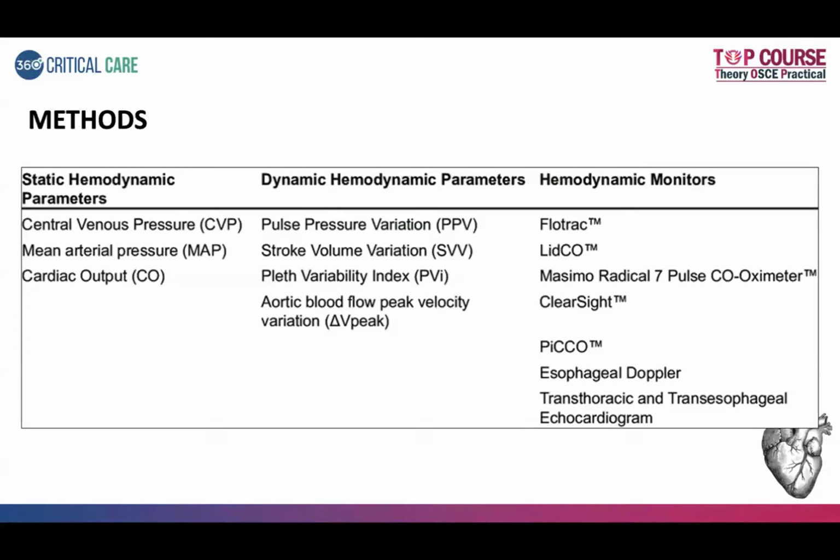Okay, so you give a preload challenge to a patient and you're seeing the response. So it is a single time response, where you are giving a preload and assessing the response. It is a single time assessment where you don't see the dynamicity, or what changes are happening inside the heart with mechanical ventilation, heart lung interaction, nothing. You are just giving a preload, checking the cardiac output change, and done. We are measuring it as a single one.